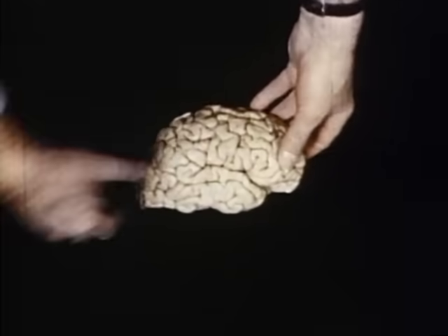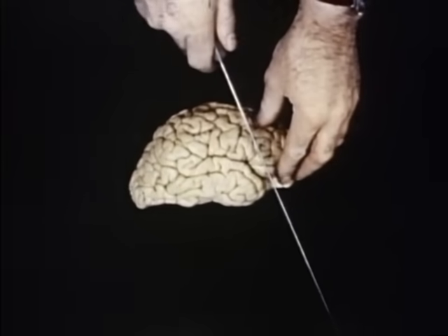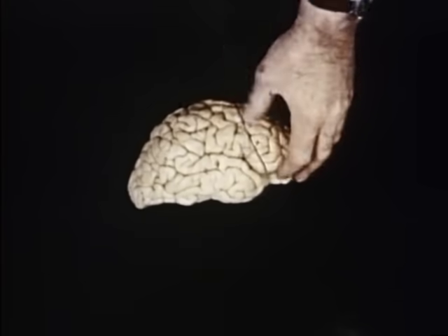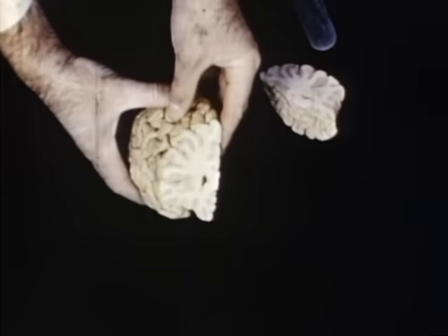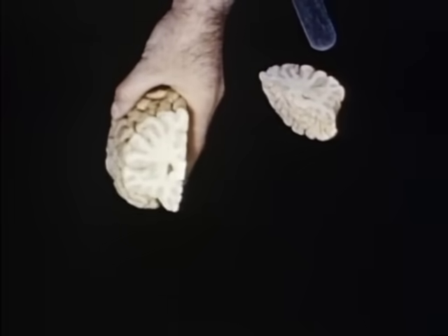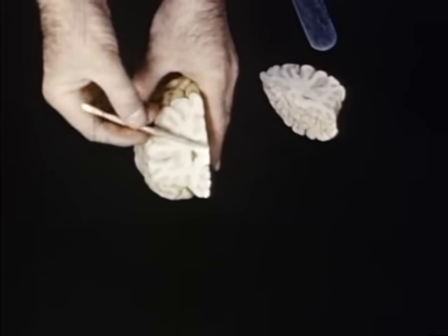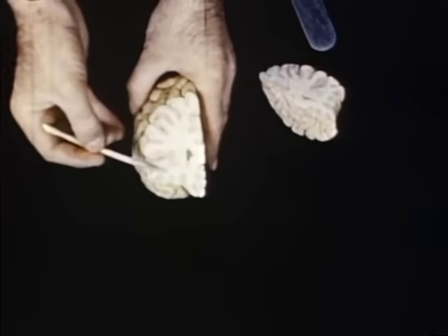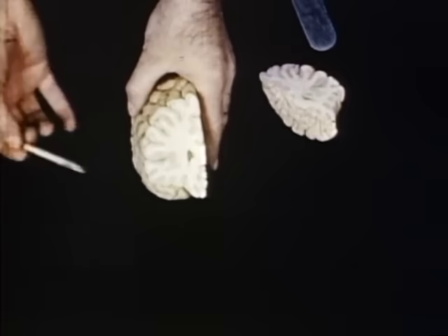Sectioning the brain in approximately the plane of the coronal suture allows us to expose certain vital points. Observe first the corpus callosum and the association pathways. Next, the fasciculus cinguli and the anterior limb of the internal capsule.